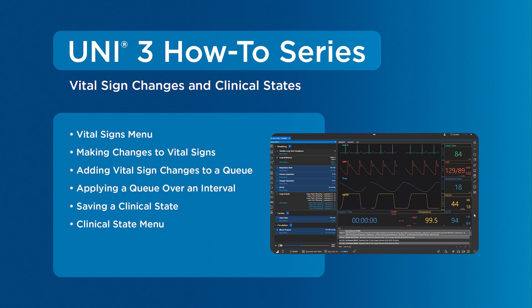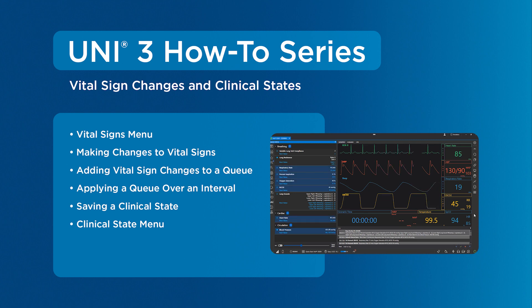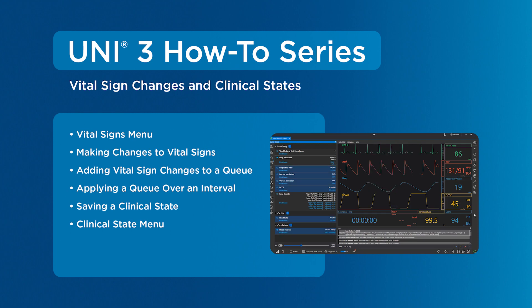First, we'll cover the vital signs menu, including making changes and adding vitals to a cue. Then, we'll cover applying a cue over an interval. Last, we'll cover saving a cue as a clinical state and accessing them in the clinical state menu.